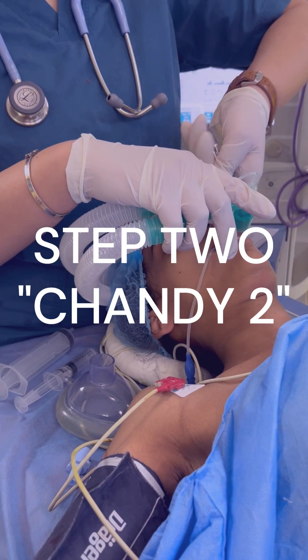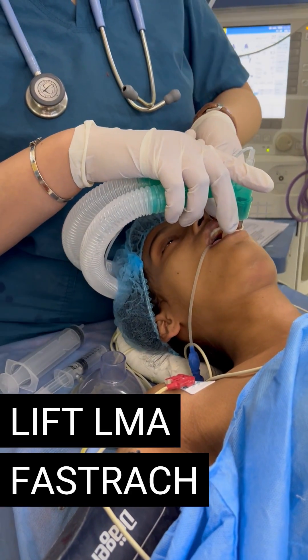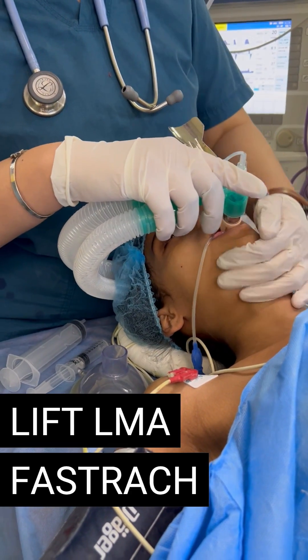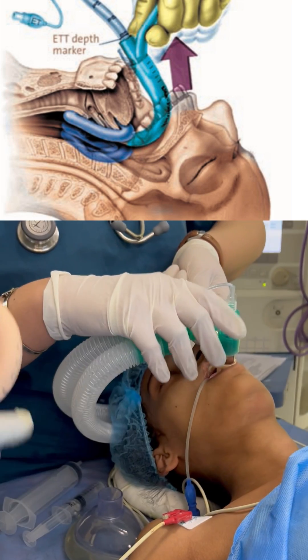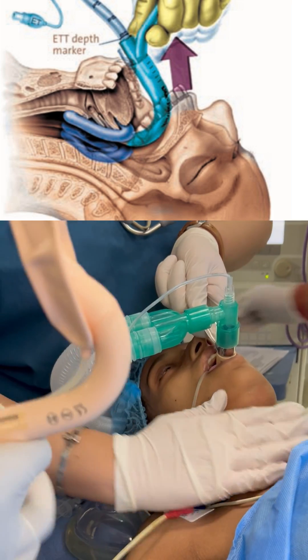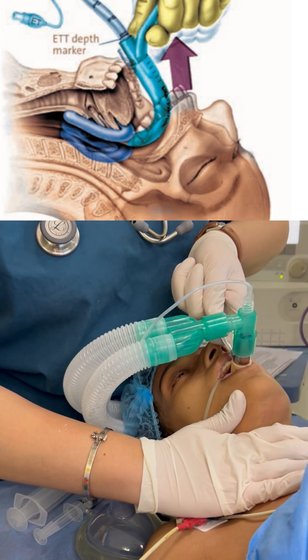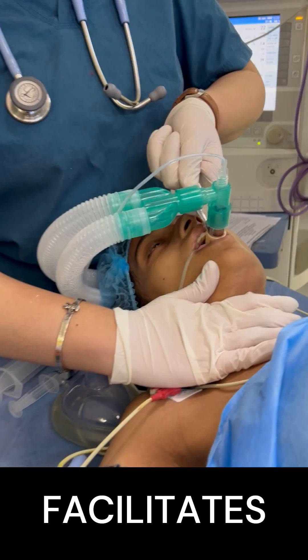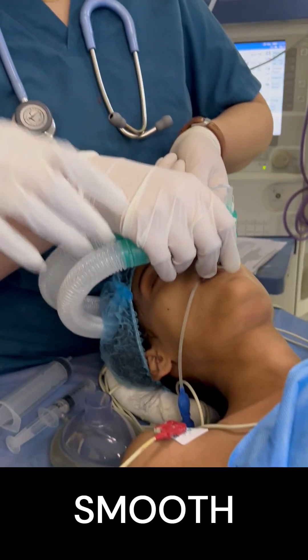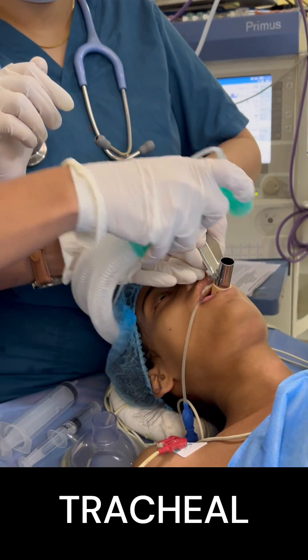Step 2 is to use the handle to lift the LMA Fast Track away from the posterior pharyngeal wall. This second step facilitates smooth passage of the dedicated endotracheal tube.